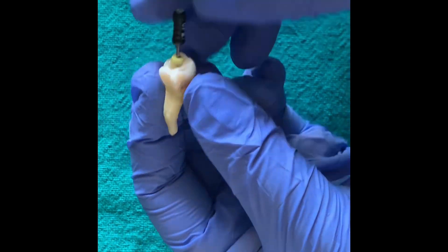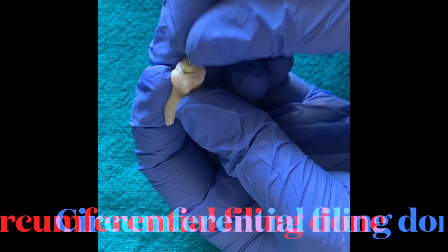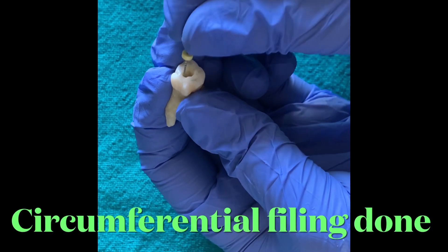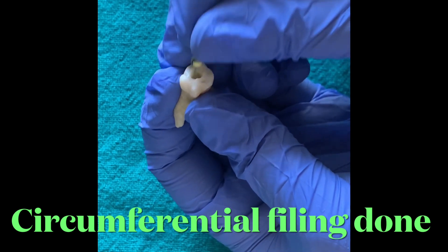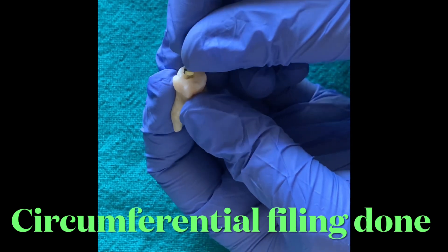Before we use any rotary instrument, it is very important that a proper canal space has been created. It is very important to always keep in mind that rotary files can only be used after there is a confirmed reproducible glide path.